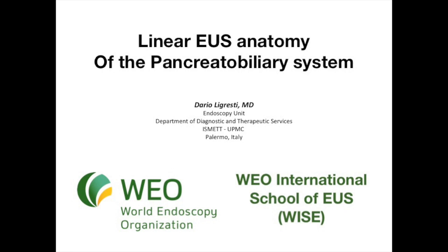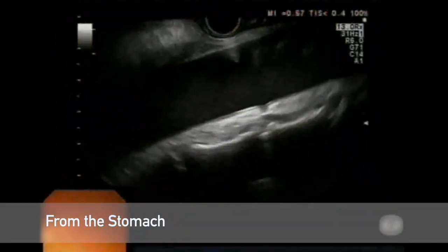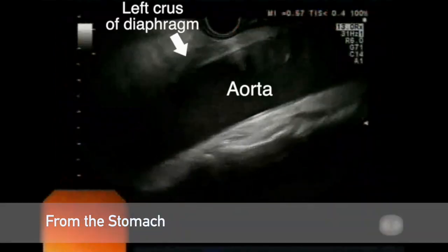This is a video about the EUS anatomy of the pancreatobiliary system with a linear scope. Starting the examination from the gastroesophageal junction, we can image the aorta with the left crus of the diaphragm above.